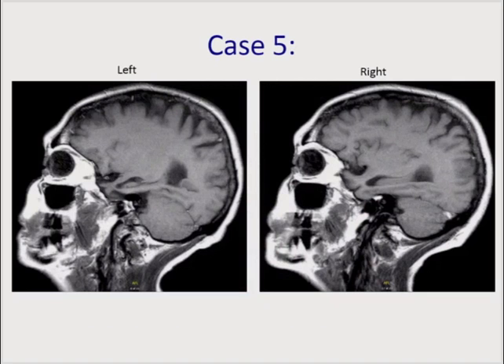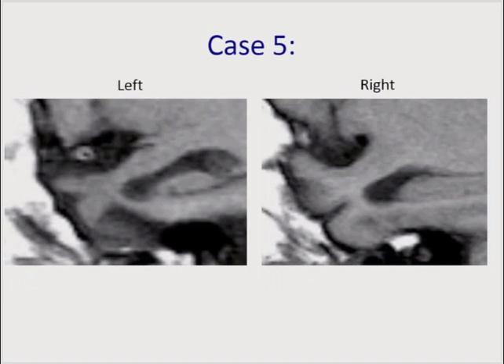And we'll look at this a couple of different ways. So here are the sagittal sections. Just compare the left and the right side, and I think it's pretty striking how much more atrophy there is on the left, again with an anterior predominance. It's sometimes referred to in the literature as a knife's edge type atrophy. So this is a blow up of that same image.